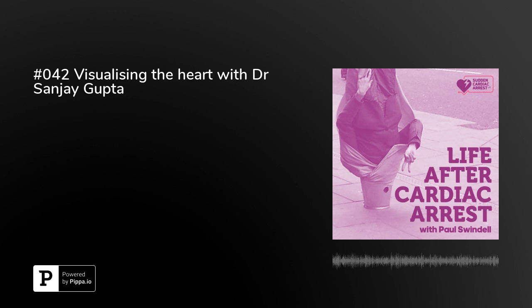Okay, so the first thing to say is that by far and away the commonest and the most easily accessible tool we have is echocardiography. One of the unique things about the heart is it's a moving structure, and therefore to try and understand it, you have to have moving images. And that is different from, say, imaging the liver or imaging the brain. Echocardiography uses ultrasound waves which bounce off different structures of the heart and produce a moving image on a screen. It's very easily accessible and is available in every hospital. And it offers a crude but well-validated way to assess the structure of the heart.